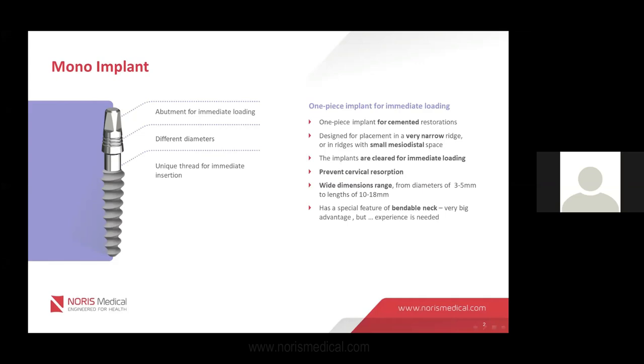So actually, we're speaking about an implant for cemented restorations. Because this implant goes out from the gingiva, this implant is meant for immediate loading. Otherwise, there is no good reason to put it in. The implants are FDA cleared for immediate loading.